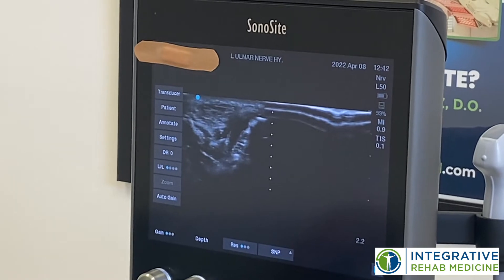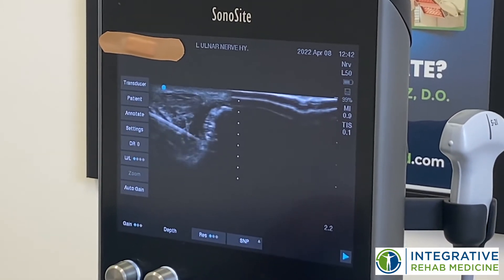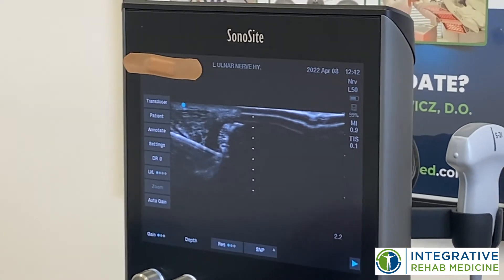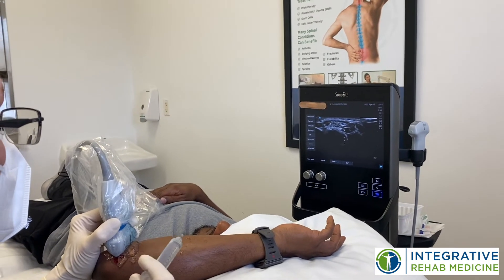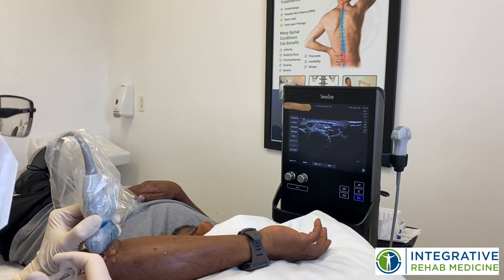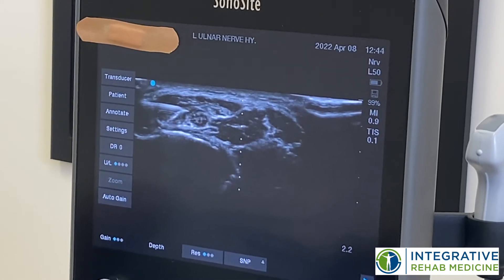Then we'll go below, and you're going to see the nerve move away from my solution. Here's the nerve underneath the flexor carpi ulnaris tendon, and this is an area that it commonly gets compressed.